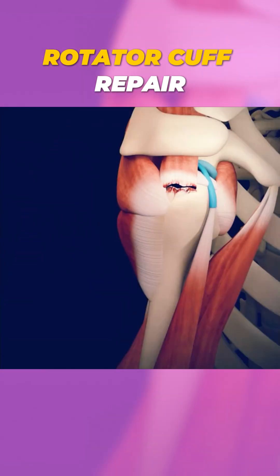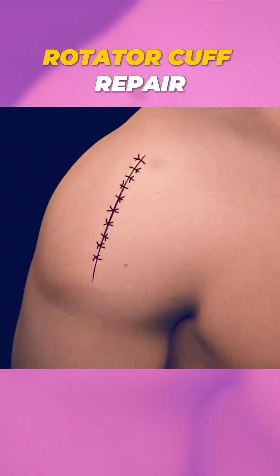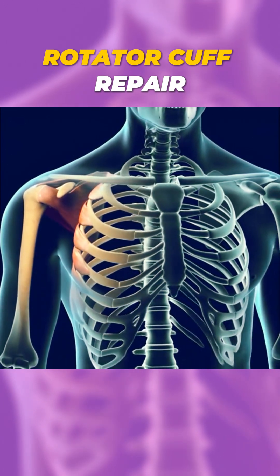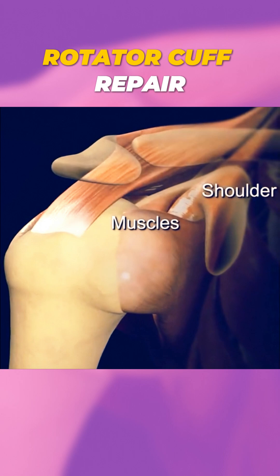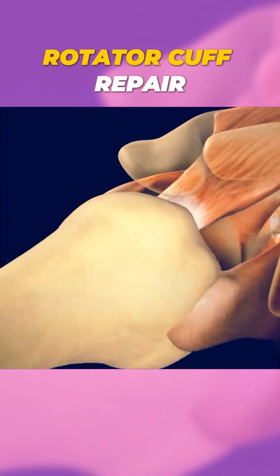Ever wondered how rotator cuff repair surgery is performed? The rotator cuff is a group of four muscles and tendons that help stabilize and move your shoulder, allowing you to lift and rotate your arm.